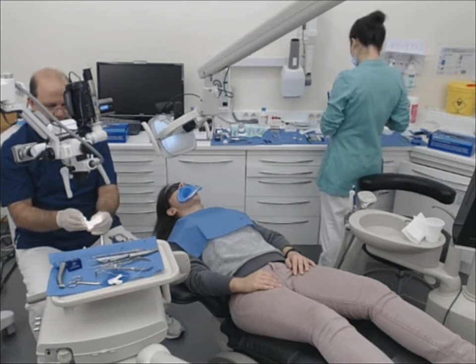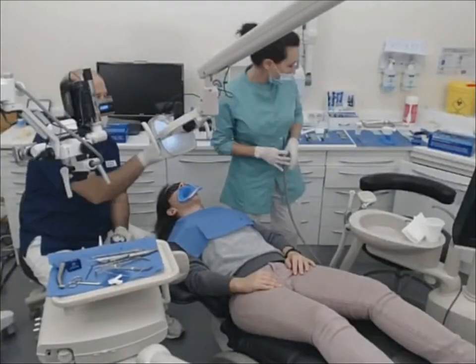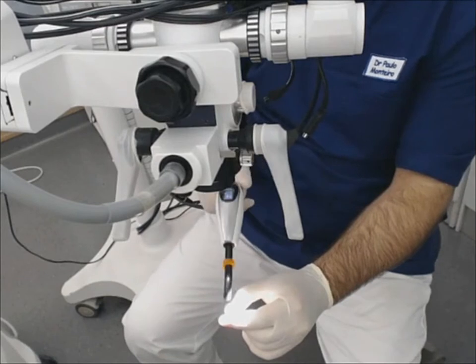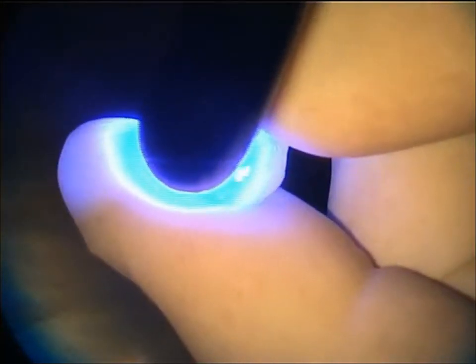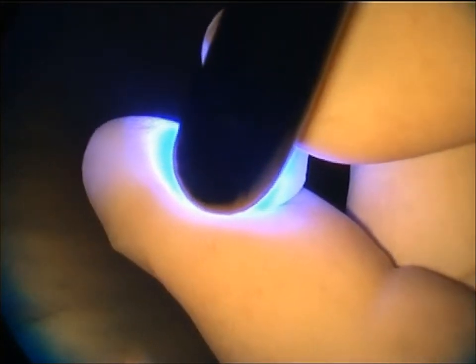Okay, in this area, I'm gonna apply the, then I'm gonna pass a little bit of gentle air, and I'm gonna let it cure. And then I'm gonna apply the tint, brown tint, and let it cure again. And then polishing it.